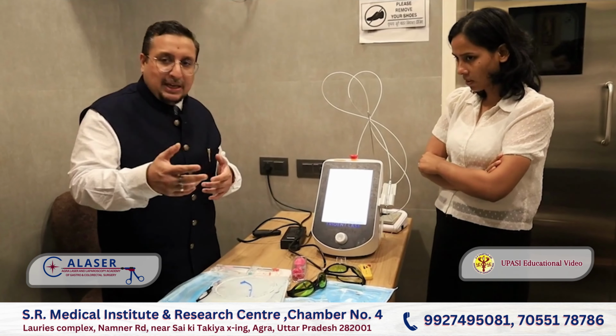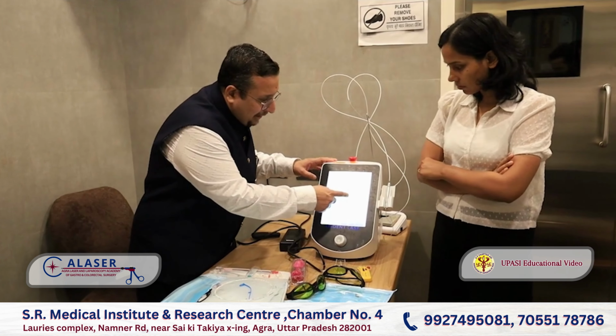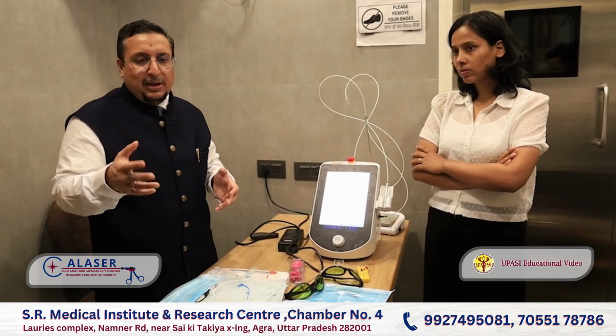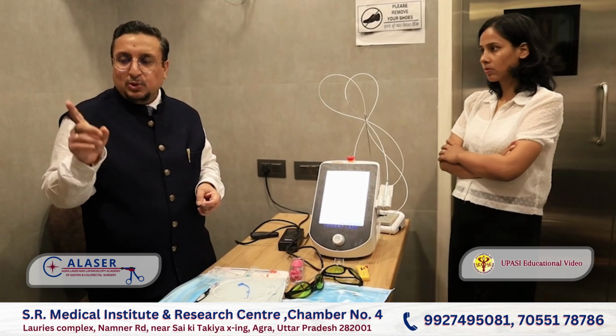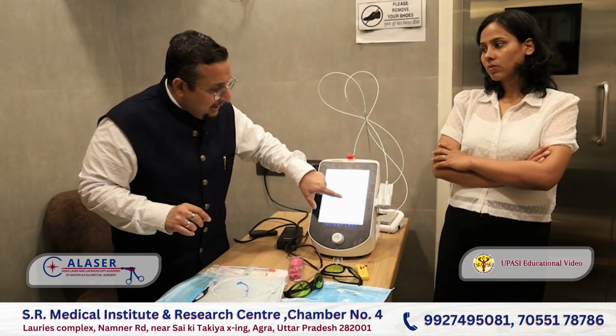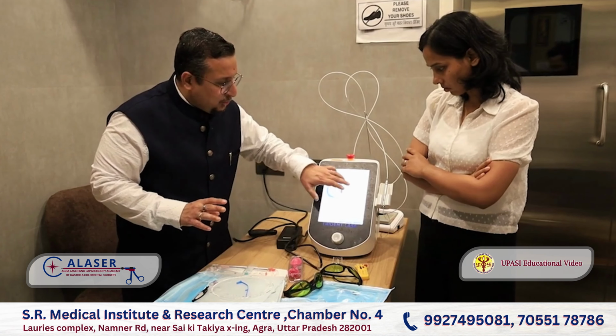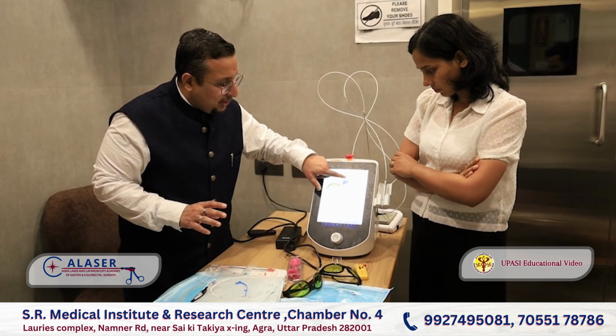So when you are delivering the energy in the tissue, you have to see the energy here. It has to be calculated. All the surgeries which we have done are calculated on the energy basis. For piles, for example, in one pile mass, we give 200 to 250 joules of energy. So in a single pile mass, you have to see here and ask the assistant to tell you, okay, it has gone to 250 joules. So the total joules of energy is calculated here. This is the T on and off, this is the emission time. So mainly three things you should know. One is the power, one is the continuous or pulse mode, and third is how much energy you are giving. Anything left?